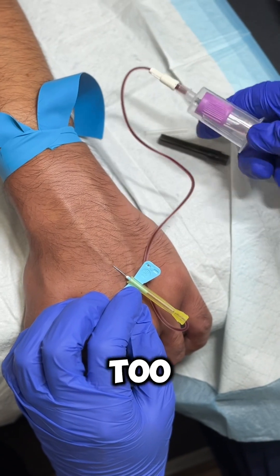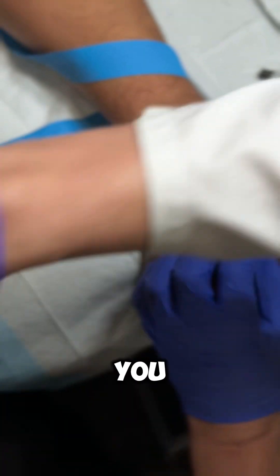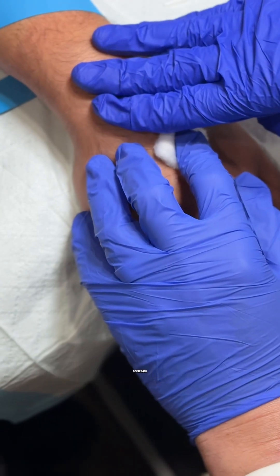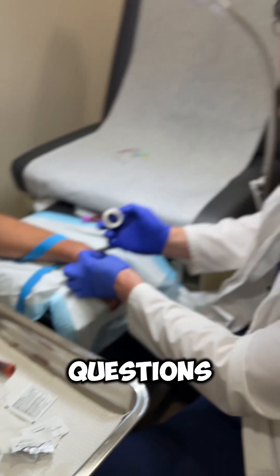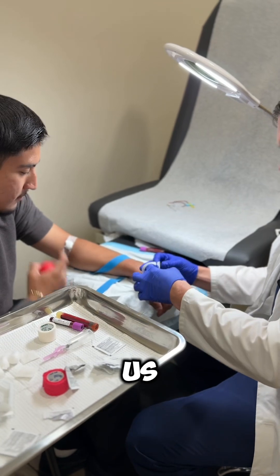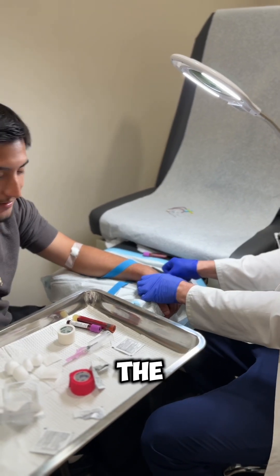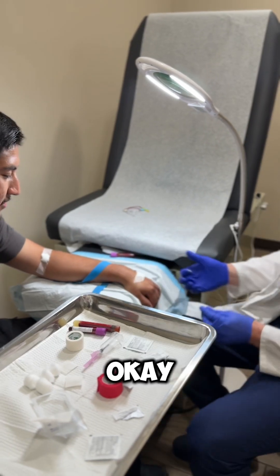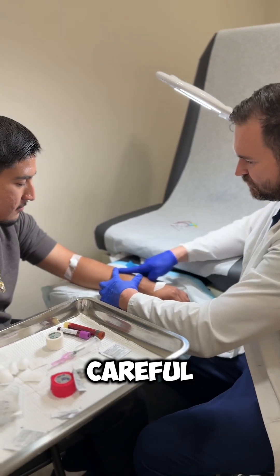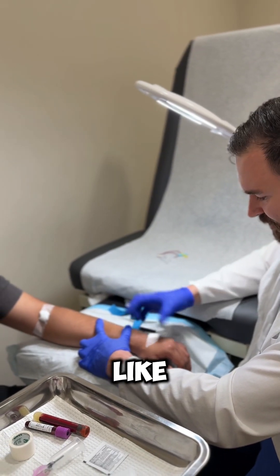I'm not going to drain you too much. Remove the tube and get the tourniquet off. If you do multiple tubes you can remove the tourniquet and still draw, but blood flow will be significantly decreased. As for common problems — moving veins, for example — you can adjust for that. My preference is to aim in the middle, approach from the side like this, and it really works well. That was a 100% successful stick.